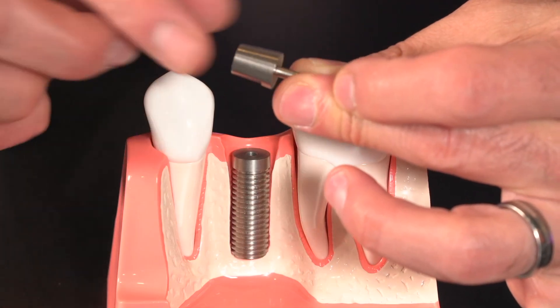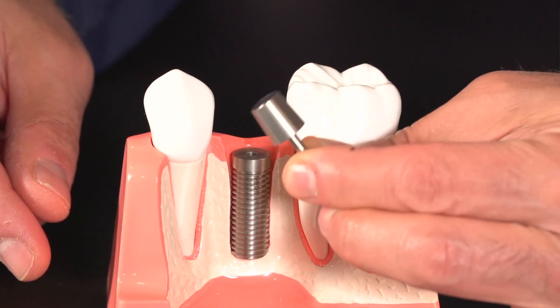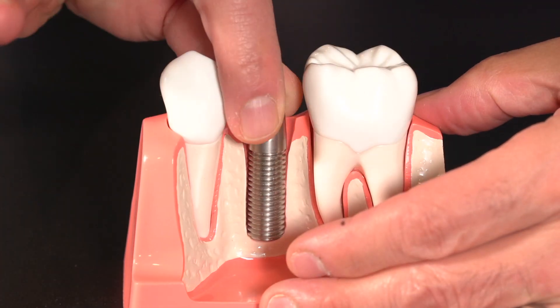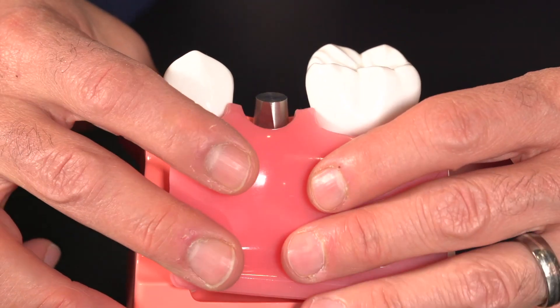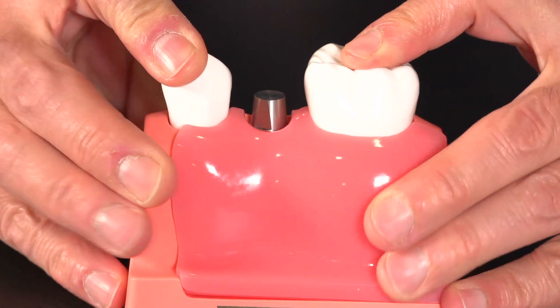The second part is a healing abutment, which is a temporary component used during the implant healing phase. It's attached to the implant fixture after it's been surgically placed, and it's designed to promote healing of the gum tissue and prepare it for the final restoration. The healing abutment may be placed at the time of implant placement as a single stage, or placed later after the implant has completed healing. It helps maintain the space between the implant fixture and the surrounding gum tissue, and gives the restorative dentist access during the impression phase.